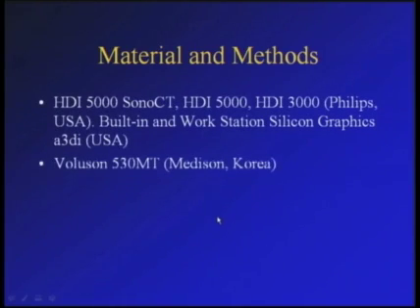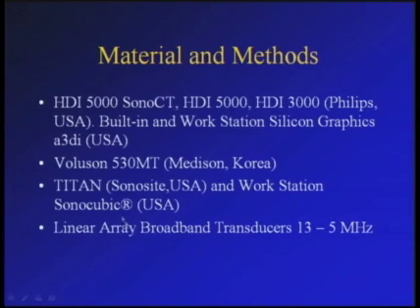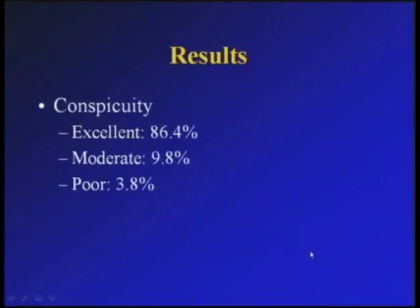And we used different technologies: automatic transducers, freehand technology, even workstations by using portable ultrasound, as you can see here. And always we used linear array broadband transducers from 12 to 5 megahertz and 13 to 5 megahertz.